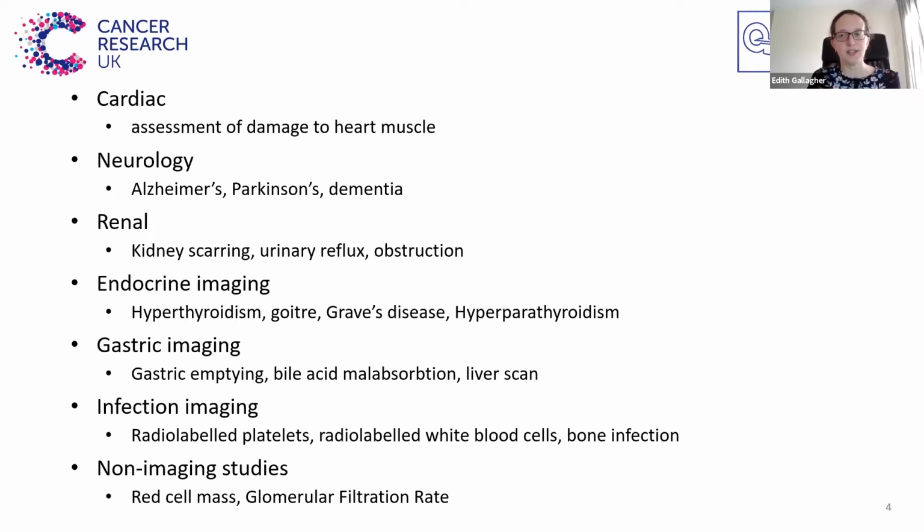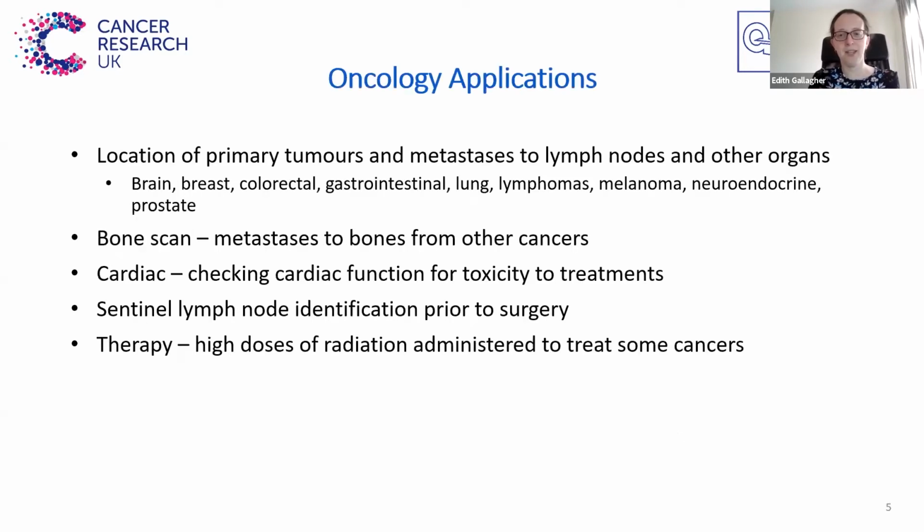I should also say that some hospitals have both nuclear medicine and PET-CT in the same department, and they come under the title nuclear medicine. And in other hospitals, they are separate. So apologies if I sometimes group the two together under one term, nuclear medicine. In relation to oncology, these are some of the areas that would have imaging performed in nuclear medicine and PET-CT. And I will go through a few of these in a little more detail later in my talk.